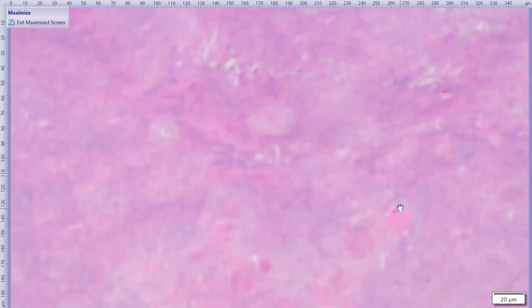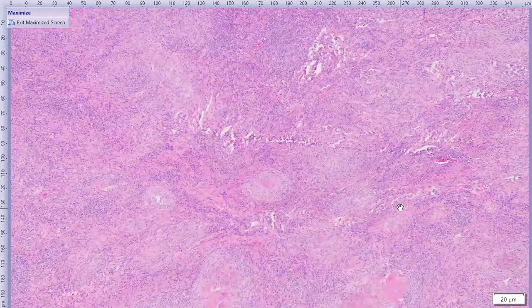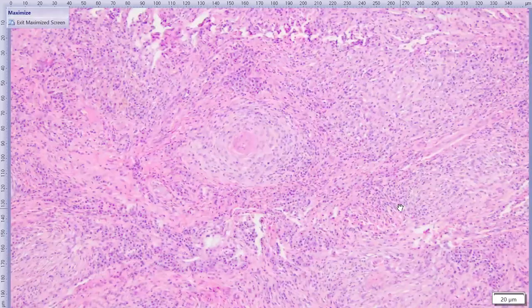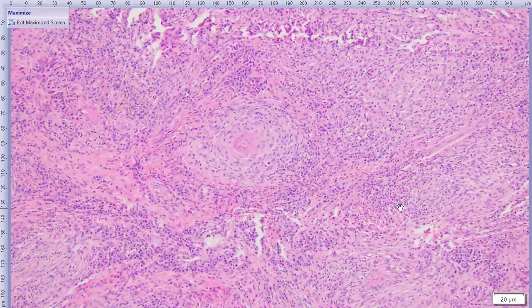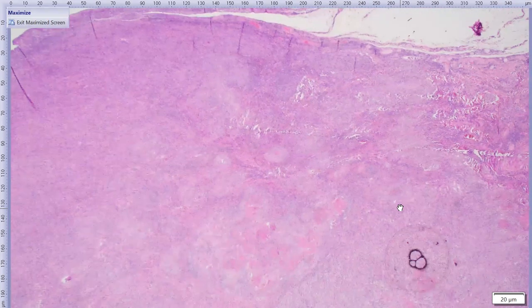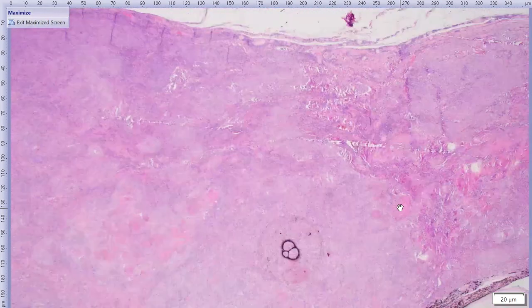However, that is one of the pathognomonic features of what is called reactive histiocytosis or systemic histiocytosis, depending on what body parts are affected and how widespread it is. And that is considered to be on the spectrum of otherwise somewhat mysterious histiocytic diseases of mostly dogs. Cats are much less often affected. So I thought this case had some interesting features of both what we would typically call granulomatous or necrotizing scleritis, and then the perivascular whorling brought up the possibility of something like reactive histiocytosis. I should add that both of those diseases are on the spectrum of idiopathic, i.e. sterile, granulomatous diseases of unknown etiology.